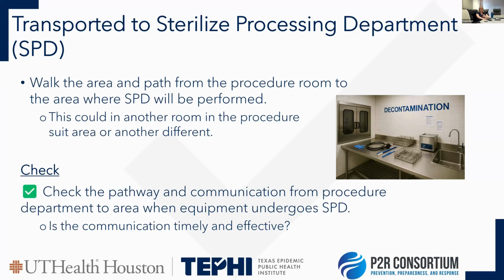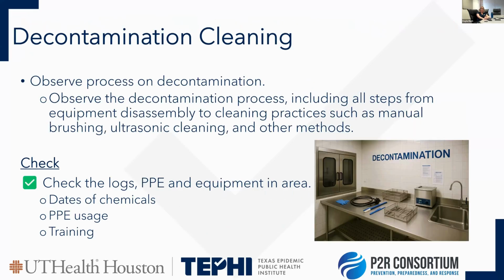Then after it's sprayed and the lid's put on, you will physically go down to the decontam, or dirty, side of sterile processing. You want to observe: is there a system where it's communicated? Are trays just dropped off? Are they in secure locations? Are they out in the hall? Are the doors propped open? Observe those practices to make sure our facility is staying safe with this equipment. There's somewhat of a chain of custody of these pieces of equipment, so that we know how it's being communicated and what the process is for getting that equipment down to where it needs to go.